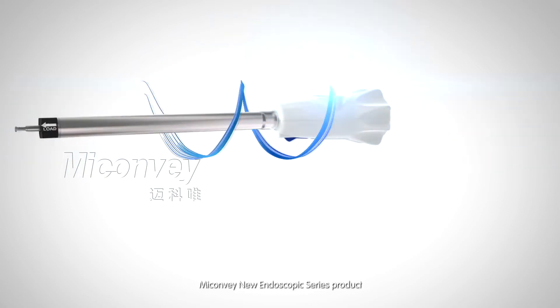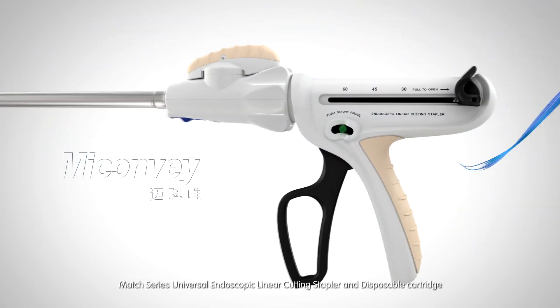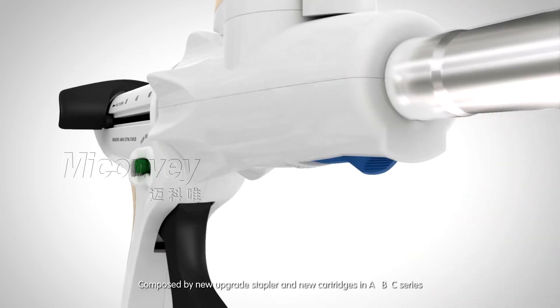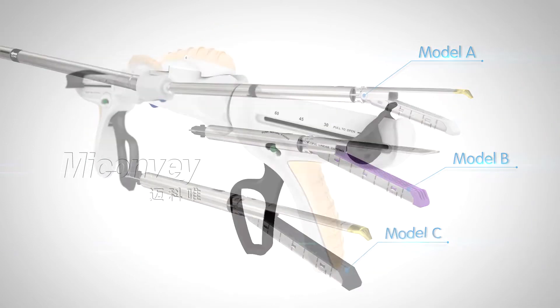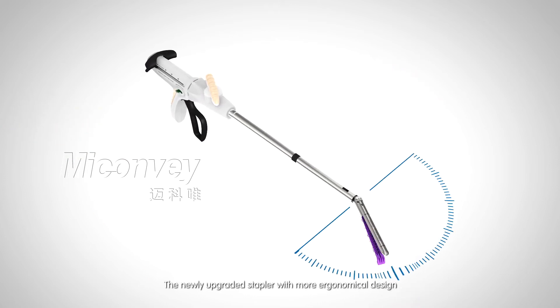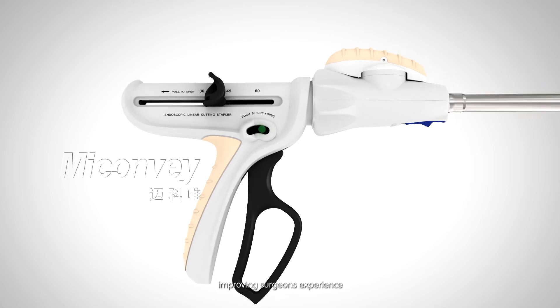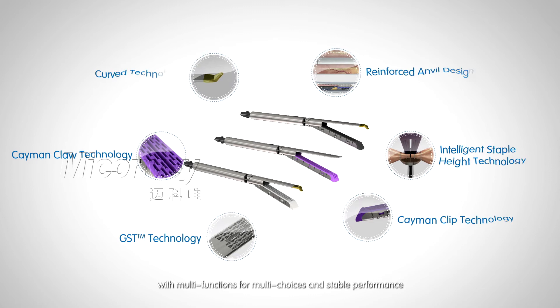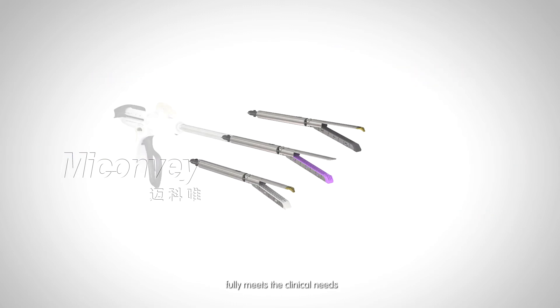Miconvey new endoscopic series product: Match Series Universal Endoscopic Linear Cutting Stapler and Disposable Cartridge. Composed of a newly upgraded stapler and new cartridges in ABC Series. The newly upgraded stapler with a more ergonomic design makes the operation easier and smoother, improving surgeons' experience. The newly launched cartridges with multi-functions for multi-choices and stable performance fully meet the clinical needs.